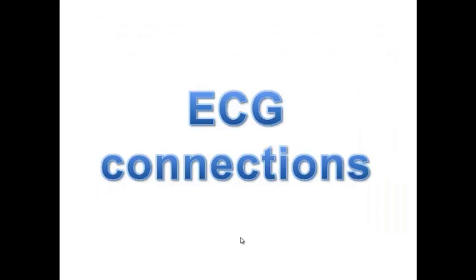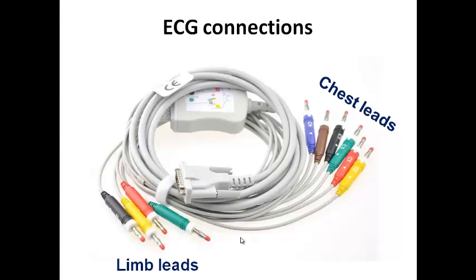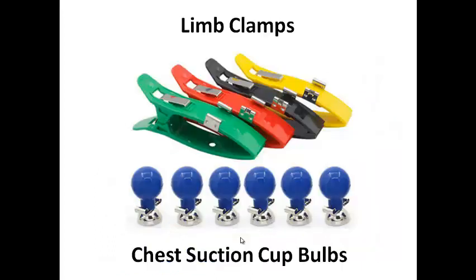We are going to speak also about ECG connection because, as we say, it may be in the job description of the nurse to do an ECG for the patient, but you need to know the normal attachment of the ECG because sometimes you may supervise the nurse while she is doing an ECG in order to make sure whether the ECG is attached correctly or not. Of course, we discussed before that we have 6 chest leads connection and 4 limb leads connection. So we have a net result of 10 connections, which will show me 12 ECG leads on the paper.